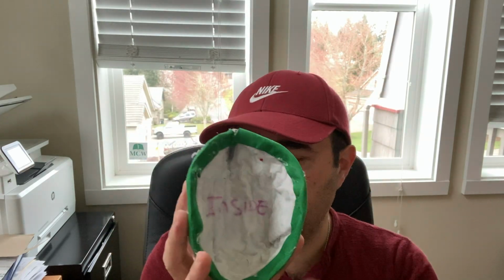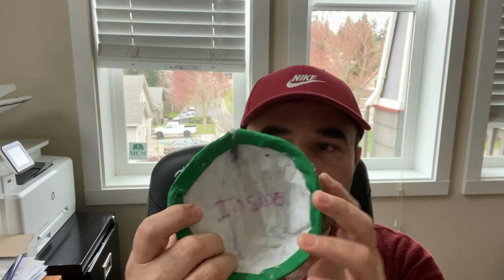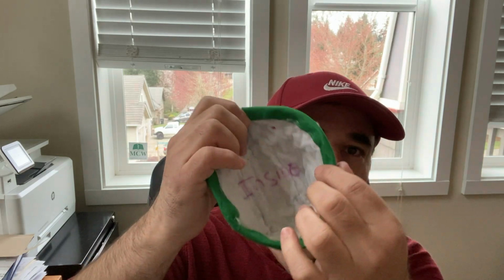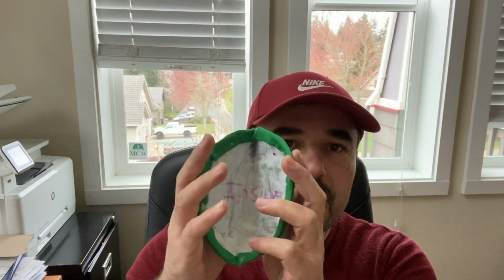Now, the only difference between what I showed you earlier and this is that I decided to glue a strip of this 3/4 inch or 1/2 inch bias tape all the way around. And you can get that at the fabric store. You can make your own. Just get some cotton fabric, cut it 3/4 of an inch, and then just glue it on the side. And the reason I did that is to give the mask more rigidity.